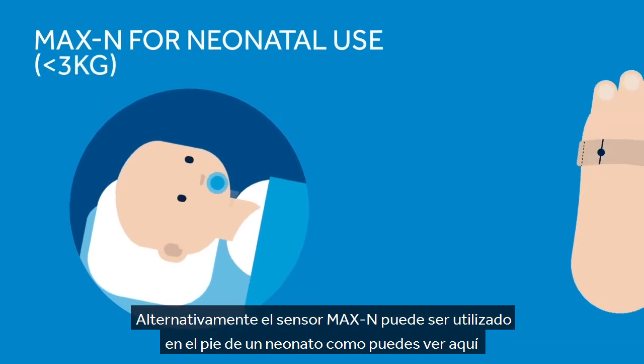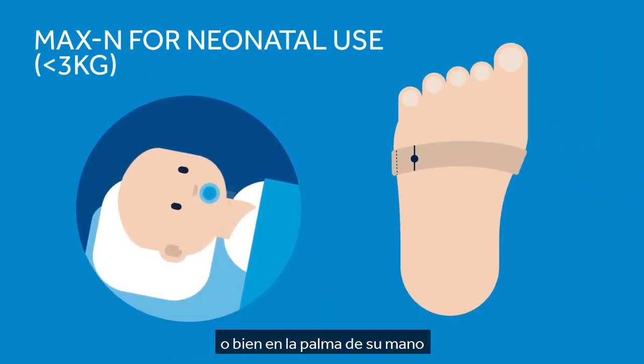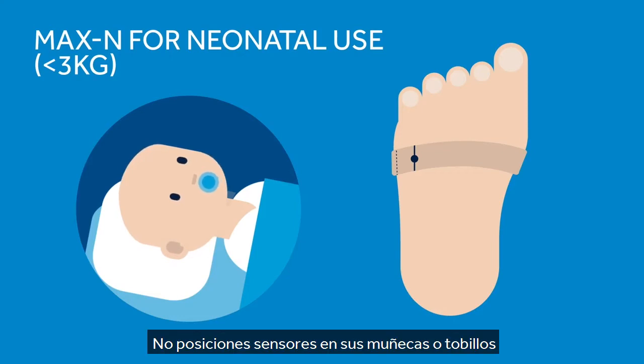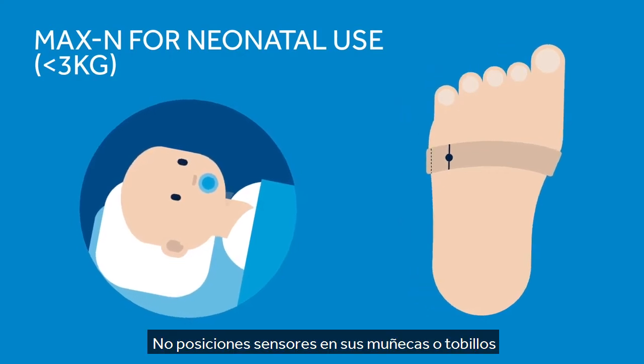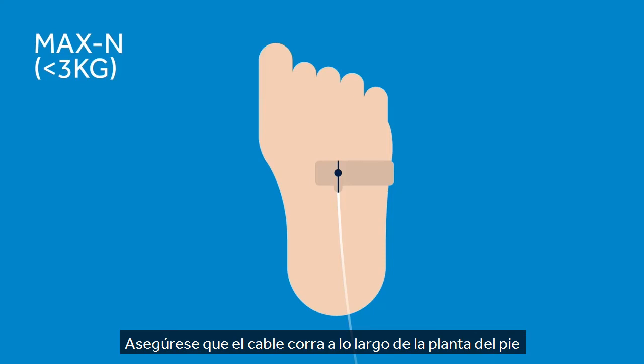Alternatively, the Max-N sensor can be used on a neonate's foot, as seen here, or the palm of a neonate's hand. Do not place sensor on the wrist or ankles. Position the sensor so the dashed line is centered on the lateral edge of the foot or hand. Ensure the cable runs along the sole of the foot.